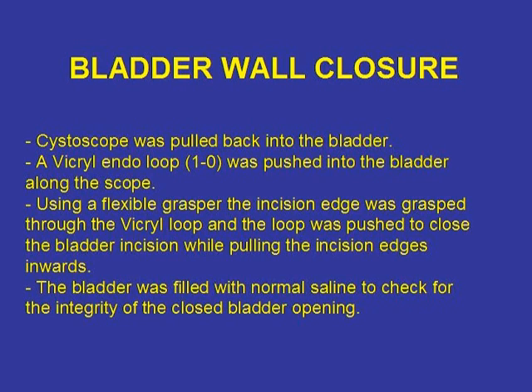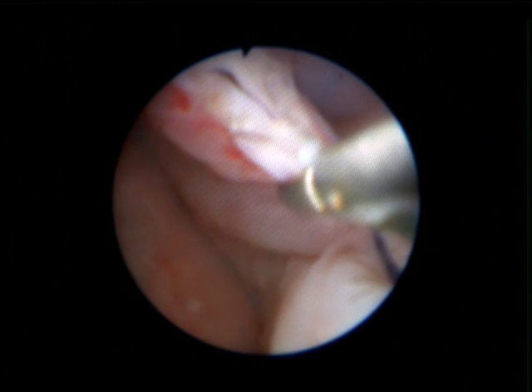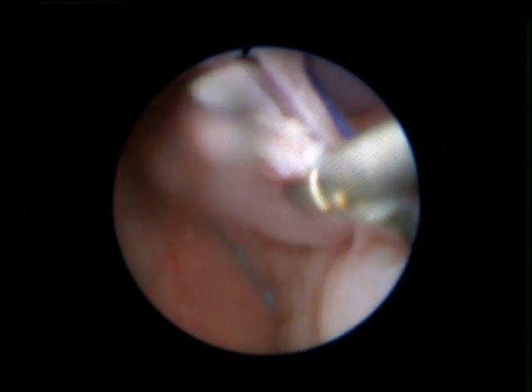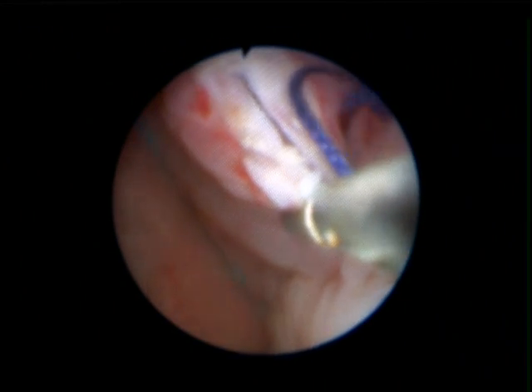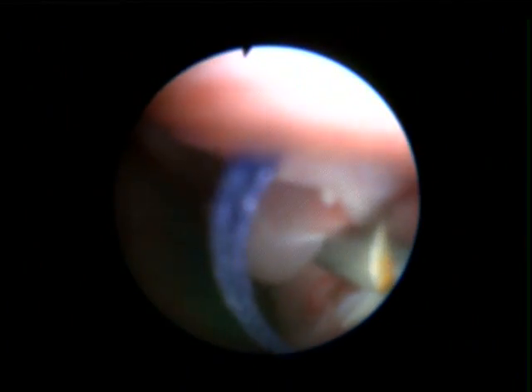For the bladder closure, we tried using catgut endo loops at first, but the catgut swelled up inside the bladder very soon and lost its integrity. The vicryl endo loop was pushed into the bladder along the scope and the edge of the bladder opening was grasped with a flexible grasper after passing the grasper through the endo loop. The loop was then closed around the opening.